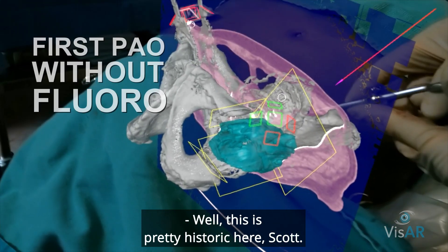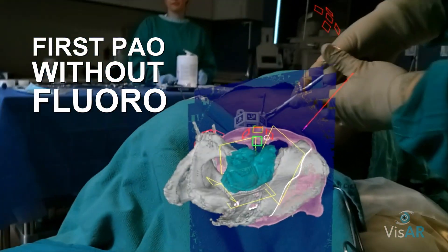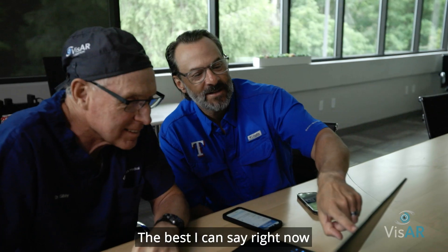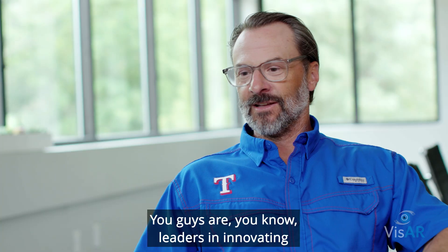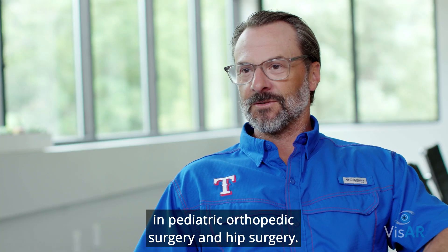This is pretty historic, Scott — this is like the first, you know. The best I can say right now is that it's exciting and promising. You guys are leaders in innovating and we can put that to use in pediatric orthopedic surgery and hip surgery. That's right.